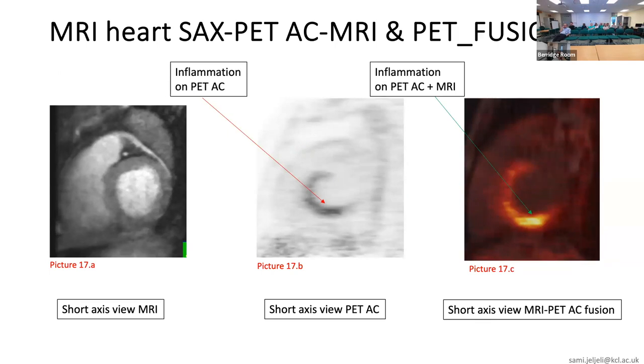And we are addressing a certain number of patients directly to PET MRI to guarantee that they have a slot in time. Also, we need to consider, maybe I'm boring you about the waiting time, but having the ability to scan a patient in the time that he needs to be scanned is of major importance. With PET MRI, we have capacity, considering that after COVID, the ramping up of the research has not been completely used.